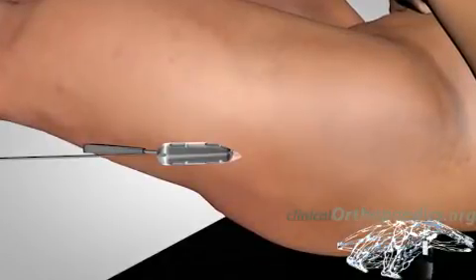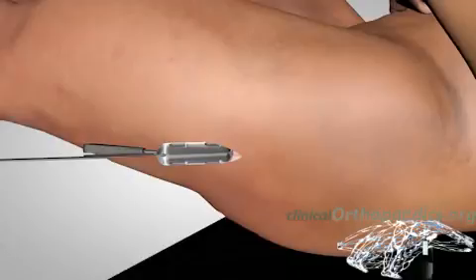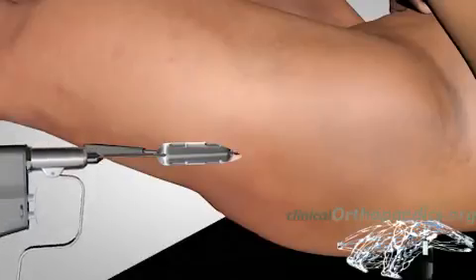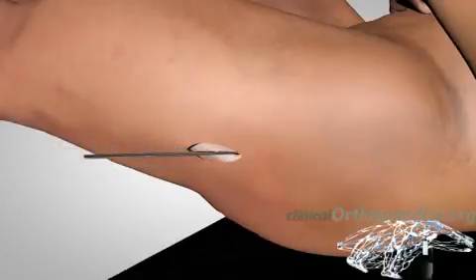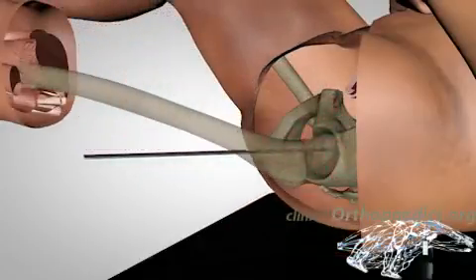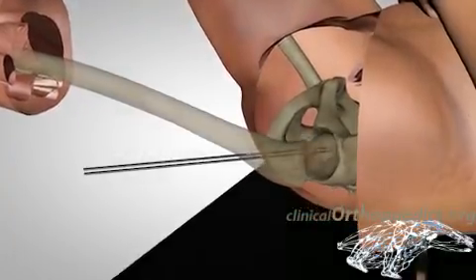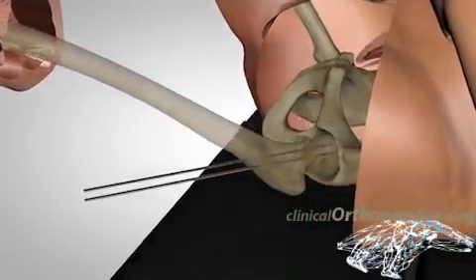Two guide wires are drilled parallel to the femoral neck, both lying centrally in the lateral view and in the front view, as wide apart as the anatomy allows, with one wire resting on the calcar. Satisfactory positions of both wires are confirmed under fluoroscopy in both planes.